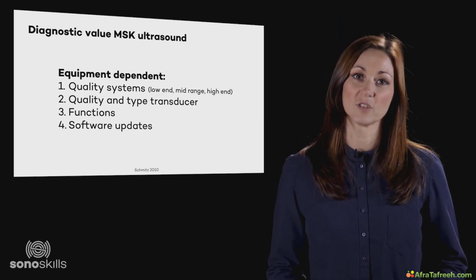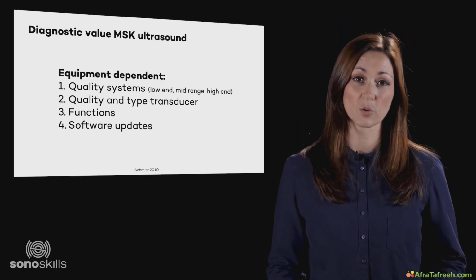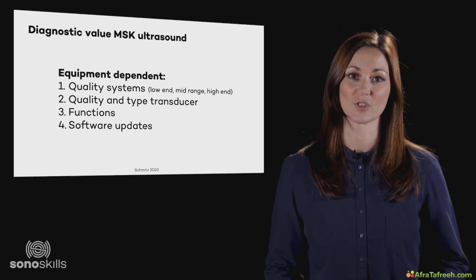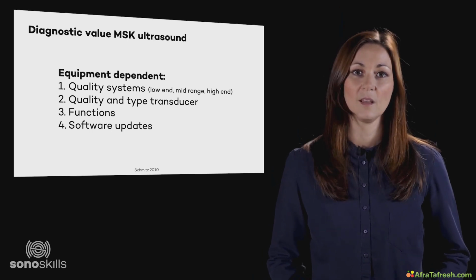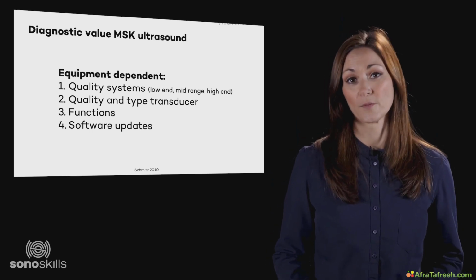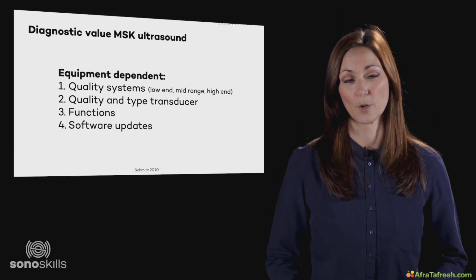The equipment you're using also affects the diagnostic accuracy. Make sure you buy good quality equipment that will serve your long-term musculoskeletal ultrasound goal. If you only wish to use ultrasound for biofeedback purposes, you can buy a different quality than if you're going to use the system for diagnostic or interventional purposes.